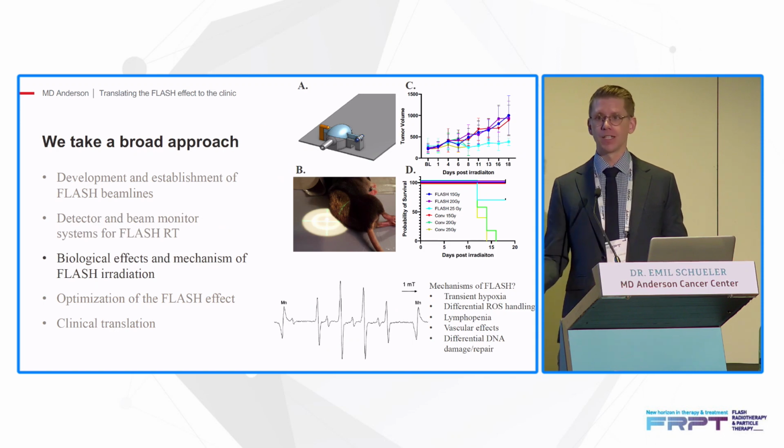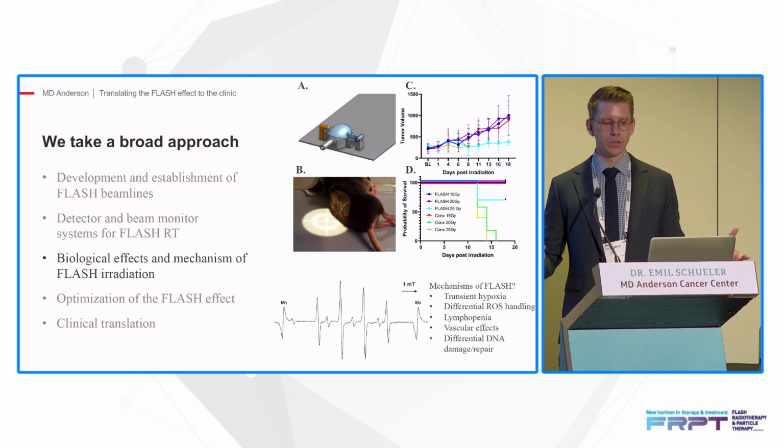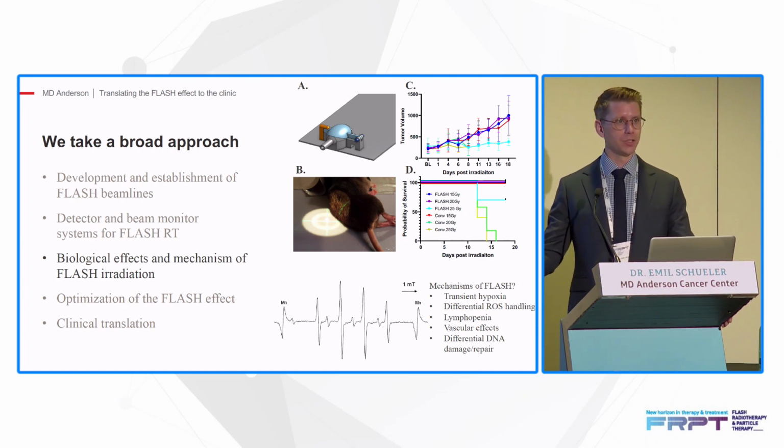The biological effects are something we're looking at a lot, and we have a comprehensive program there, both when it comes to immobilization devices for our animals, as well as actually conducting the animal trials and in vitro trials as well.